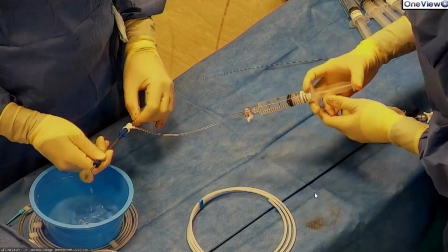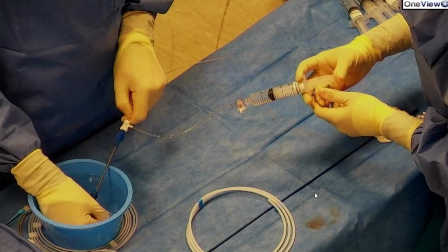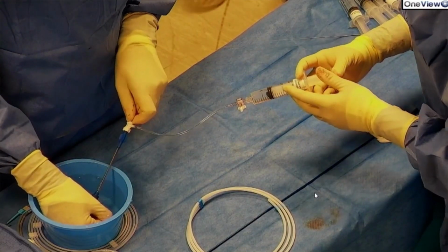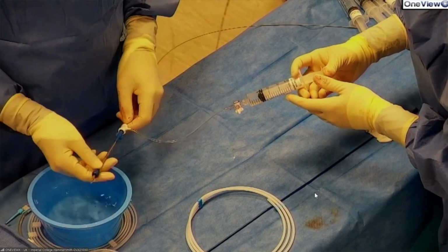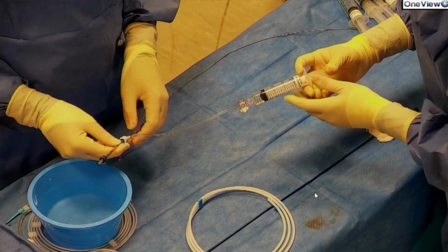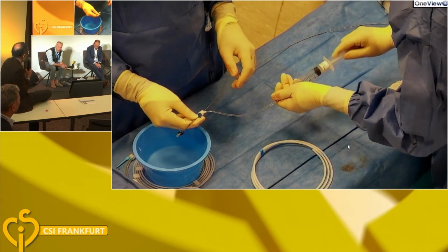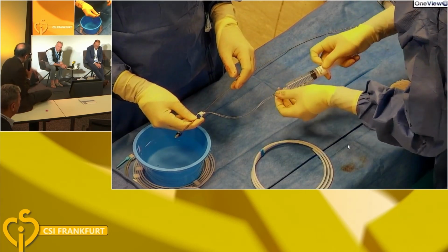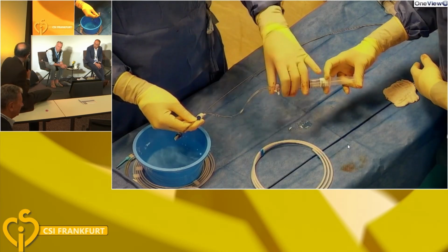And a bit like an Amplatz, it's about 8 turns, and then we always go back one or half a turn just so that we can deploy it in the body. So Neil, under the hand there, you're stretching the device. I don't know if everyone else stretches the device. I think if you stretch the device and pull it in, you're less likely to catch the braiding and produce a cobra. And the bigger the device, like an ASD device, the more important it probably is to stretch. Dave, do you stretch?